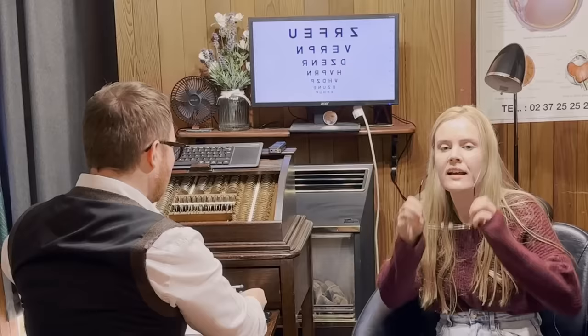Yeah. So, essentially, with your prescription, you're a little bit short-sighted, as you said. That means things in the long distance are blurry without glasses. The good news is not wearing glasses does not make that any worse. It doesn't damage your eyes. Likewise, wearing the glasses more doesn't make your eyes more dependent on them. It doesn't make the short-sightedness worse. So it is just in the moment, it makes it clearer. It's nice and straightforward with the short-sighted correction.